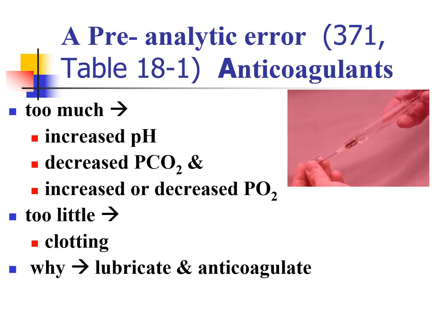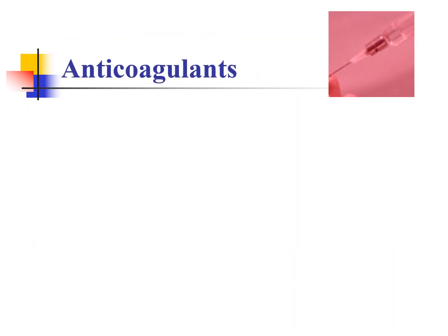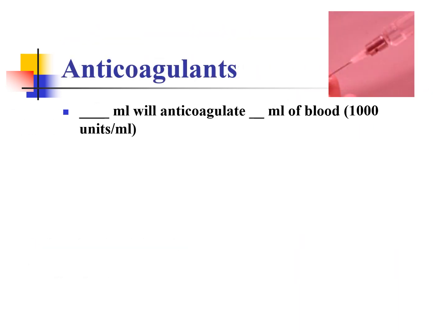And air bubbles in a blood gas syringe are also bad, because atmospheric PaO2 is higher than blood PaO2, right? Remember, we talked about this back in pulmonary A&P. Remember, it's normally like 149 or something like that. So if you have a really high PaO2 in an air bubble, that will artificially increase the PaO2 of the blood. So that's not very helpful at all.